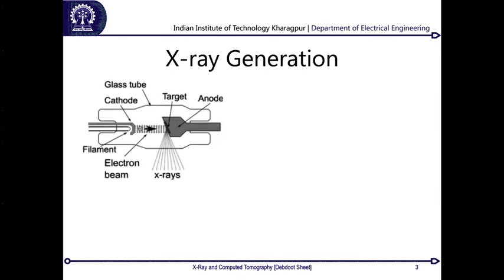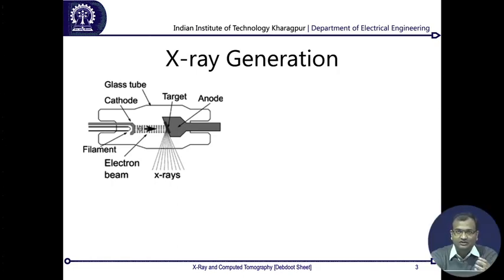there. So, actually you will be having some sort of a thing called an X-ray tube, and this is the source from where an X-ray is generated. Now, since it is not basically an optical photon, unlike your LED lights or your tungsten filament lamps where you just pass electricity and it is directly generated, over here it is through an indirect process. So, over here what is happening is, you basically have a cathode which is heated up, and then you have a lot of electrons which are just flowing out.